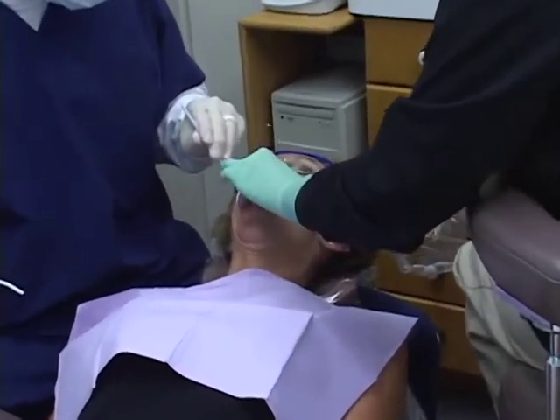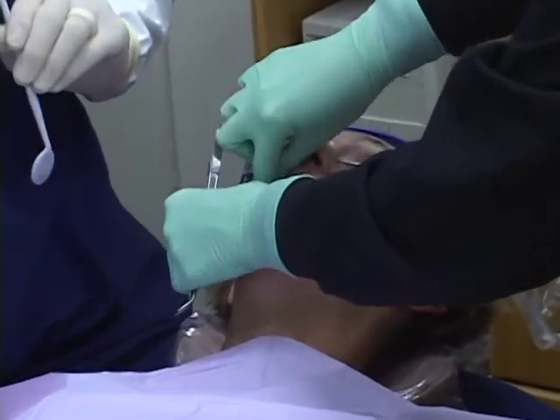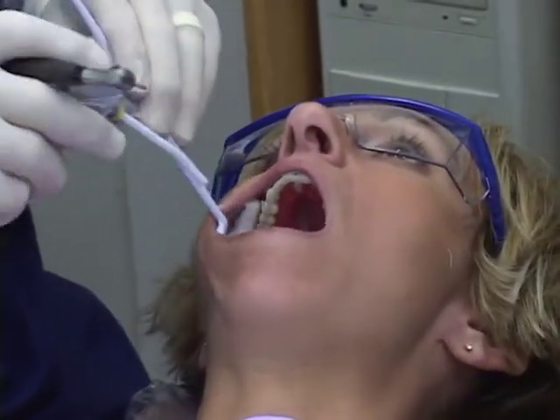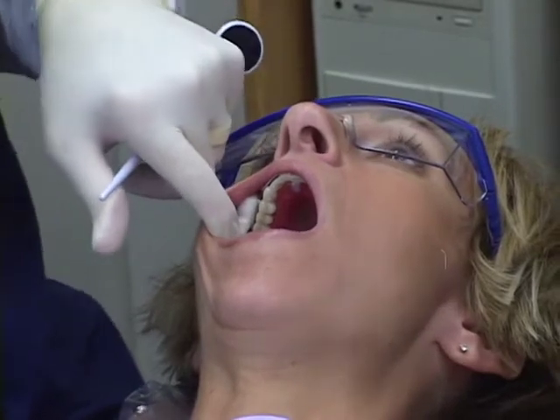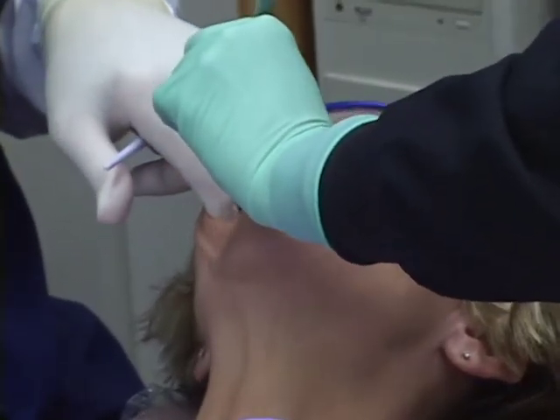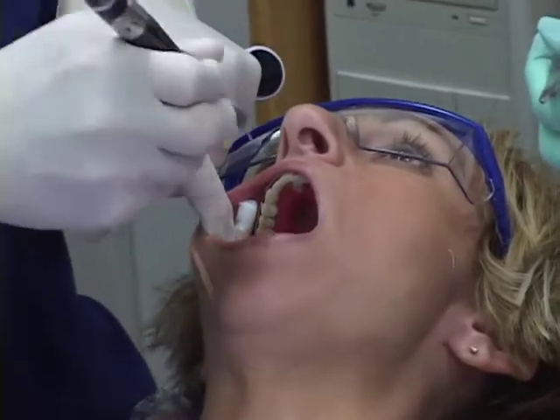I'm going to go ahead. I like to use these for keeping dry. These are called absorbables. They're very nice. They're rolled cotton, much nicer than plain cotton rolls, and much more absorbent. We're going to start here with black film, please. Debbie, go ahead and chop, chop, chop, chop. Open. Okay. And as we expected, we have our little spot right here.